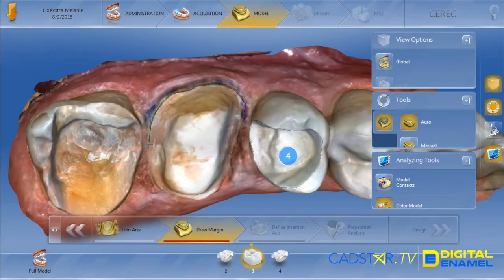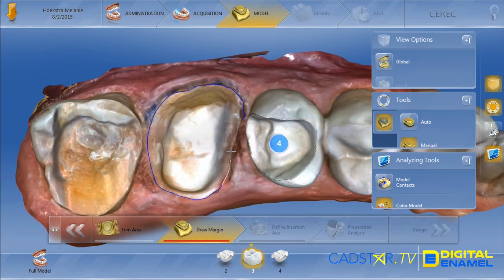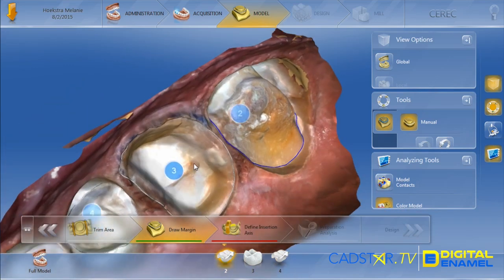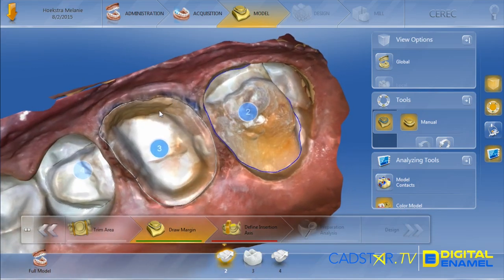Here's the process I go through to effectively draw my margin. I quickly draw my margin — even if it's not centered right on that margin, I just loop the tooth as quickly as I can and then I'll go back and edit. Quite often I'll turn my die upside down so I'm looking at the margin like a traditional impression. It's kind of the way my brain works — I've been looking at traditional impressions for years.